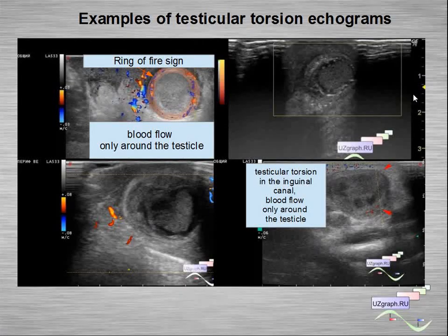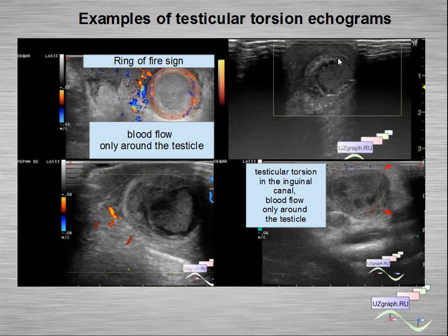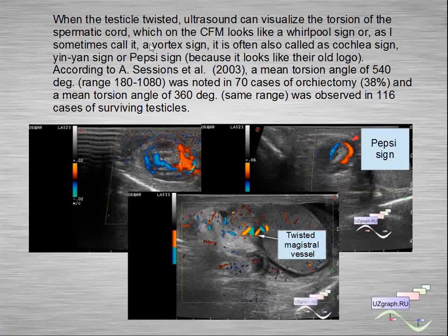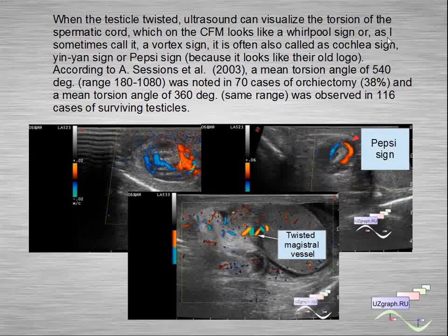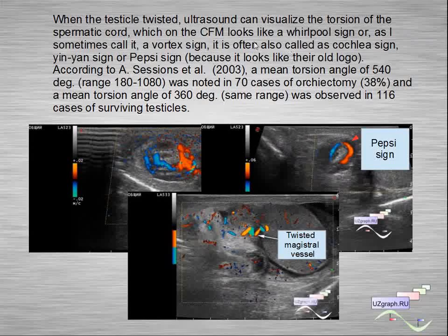Examples of testicular torsion echograms: we can see the sign of ring of fire, with no blood flow inside the testicle — only around it. Another echogram shows necrosis in torsion testicle. Another testicular torsion with necrosis, and another testicular torsion with necrosis inside the inguinal canal. When the testicle is twisted, ultrasound can visualize the torsion of the spermatic cord, which on color flow mode looks like a whirlpool sign — sometimes called a vortex sign, cochlear sign, Inyan sign, or Pepsi sign.